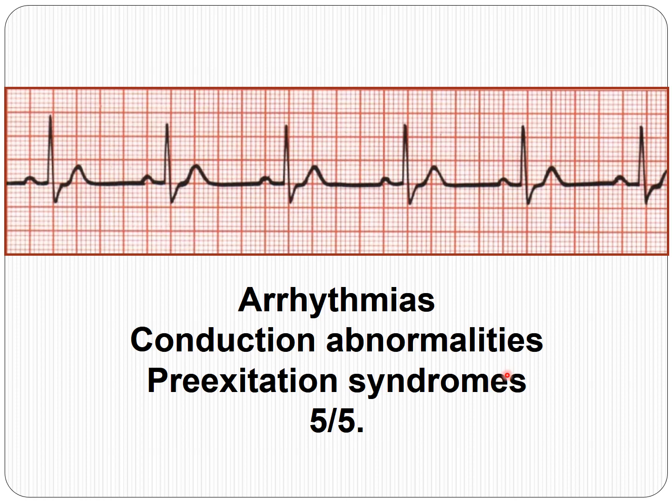So far, we were talking about the slower conduction, the conduction abnormalities. The conduction abnormalities can be faster. This kind of faster conduction occurs where normally the slowest charge propagation is going on, and that's the AV junction. In the AV junction, we do have some accessory pathways that are going to bypass the slowdown of the AV node. These syndromes are called preexcitation.